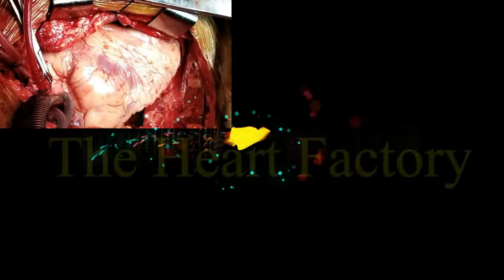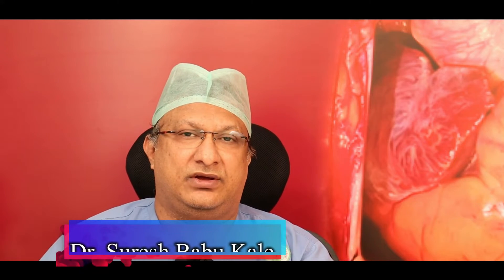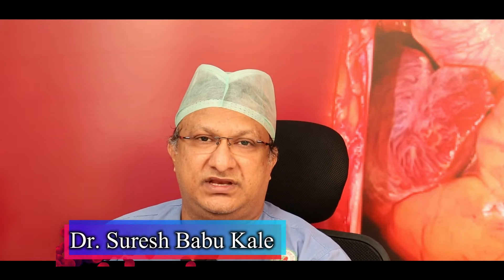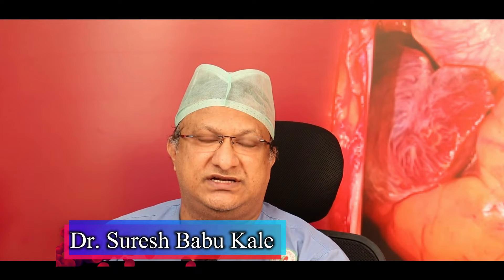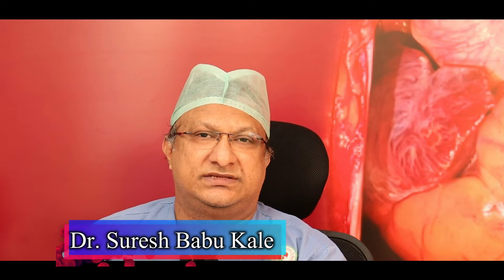Welcome to another video from the Heart Factory. Today's video will be on the technique of bioprosthetic mitral valve replacement with regards to the placement of the struts, the various techniques of mitral valve replacement, some knowledge about the rinsing of the bioprosthetic valve, and the effects of aldehyde or formaldehyde on the calcification of the valve.